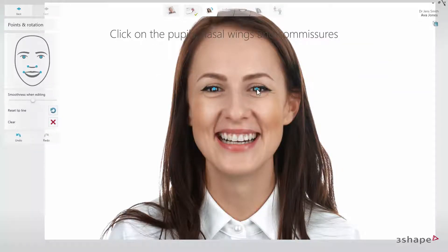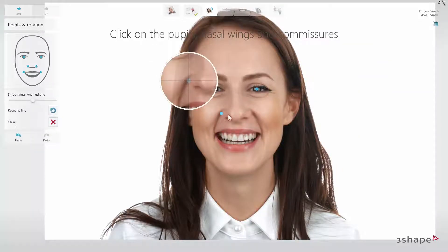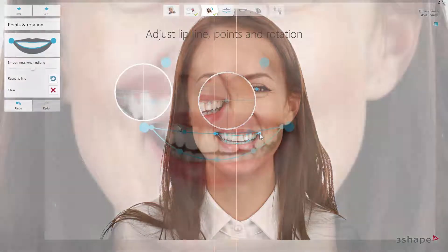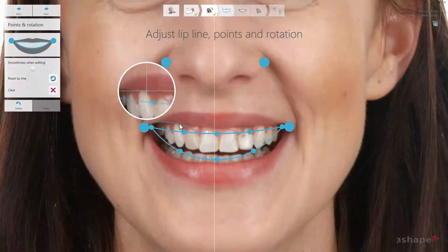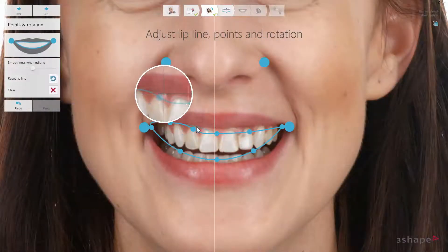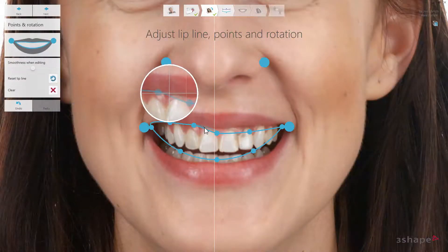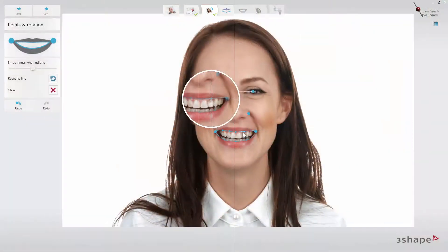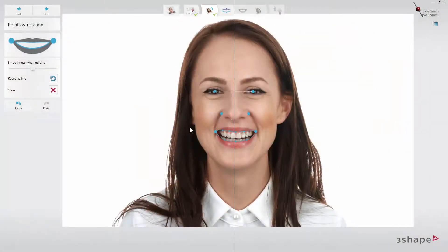Perform the alignment of the photo by placing three sets of reference points and adjust the lip line as well. Now move on to the next step where you will create your smile design for the patient.